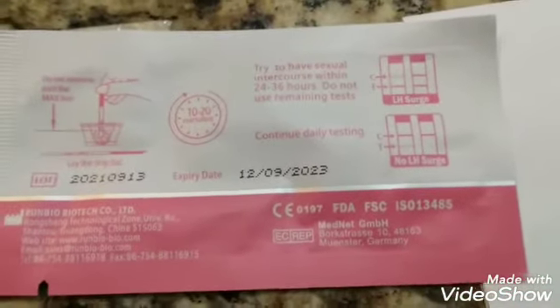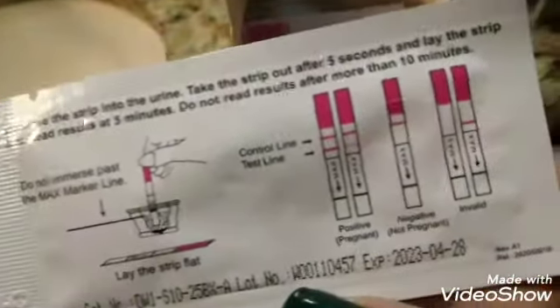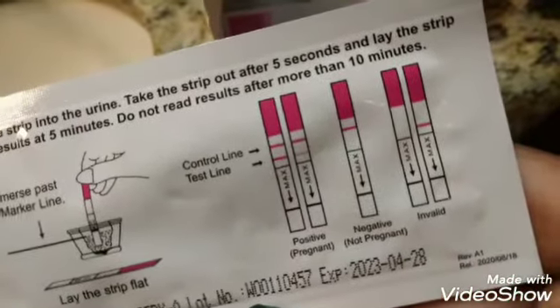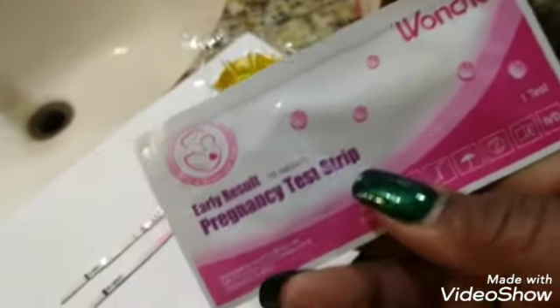This one, the OPK, came with an expiration date, and it is now March 14th. And look at that expiration date, fellas. Way over there, so that's awesome. This one, expiration date is somewhere around here. Also awesome. So I have a year's worth of use easy on these. Try not to go crazy on the Wondfos. If I see anything on it, I'm just going to stick the 88-cent Wallies, the First Signals, in between and save these bad boys.